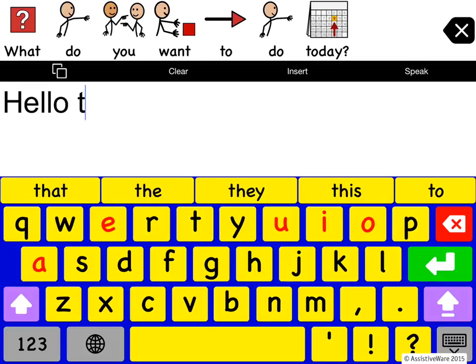But if you're finding that someone's really spending a lot of time in the typing view, it's really time to consider looking at Proloquo4Text. Proloquo4Text is an AAC application that we designed specifically for literate users, and it's really highly optimized for those users. So we're finding that many of the users that are using Proloquo2Go and are spending a lot of time typing transition to Proloquo4Text and that it significantly increases their efficiency in communication. And Proloquo4Text, because it's not symbol based, also looks a little bit more mature, which is something many users also appreciate.